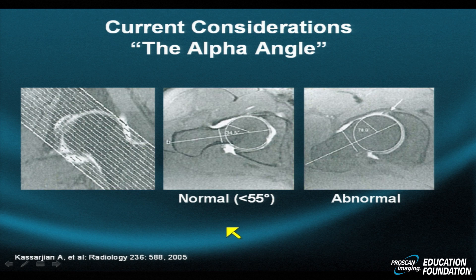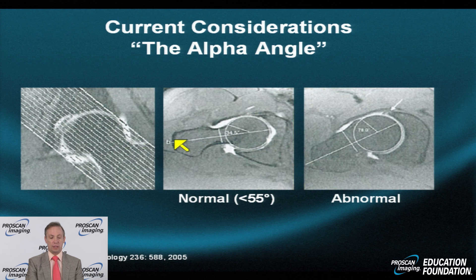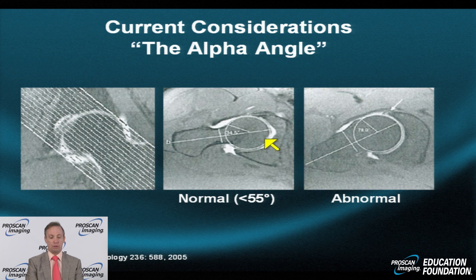One measurement used to assess the bump and the risk for FAI is the alpha angle. An oblique long-axis axial is created so that a line along the long axis, from the greater trochanter splitting the femoral head, is combined with a line drawn from the center of the spherical femoral head to the transition point between the head and the neck. There is some subjectivity in this measurement.